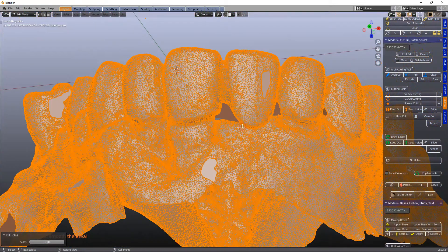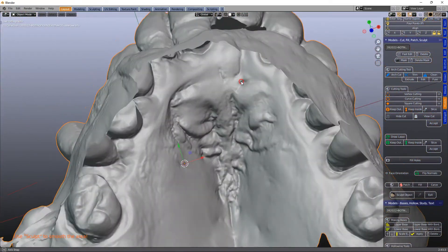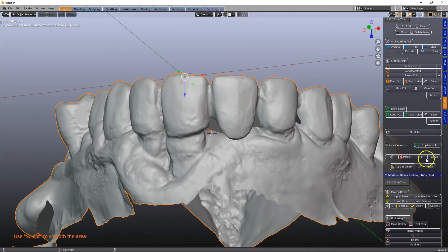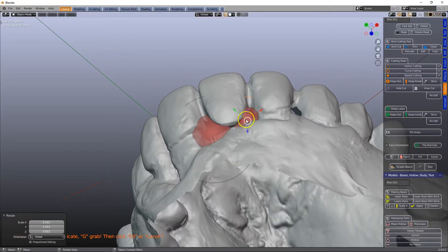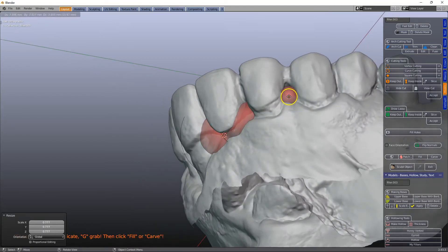Otherwise in the video before I did the scaffolding. So now what we're going to do is shift right-click to place the cursor, go to Patch Up, S to scale. So basically what I want to do is make sure that we're going to get a nice structure underneath here. So Shift+D, S.